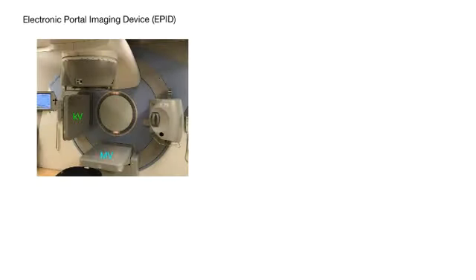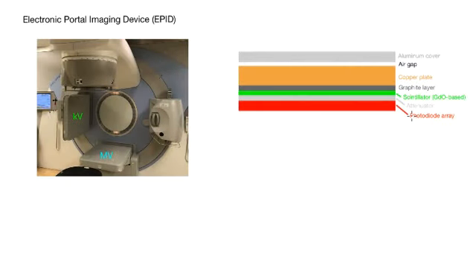Here's an example of a detector in the therapy context. Actually, two of them. This is the electronic portal imaging device. We call it the EPID. And in this system here, you'll see two detectors, one for the megavoltage beam, MV, on the bottom, and one for the kilovoltage beam, which goes sideways, kV. So let's look inside the detector, and we'll use the MV detector as an example.